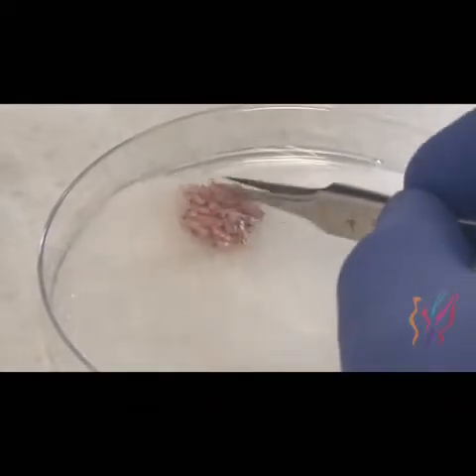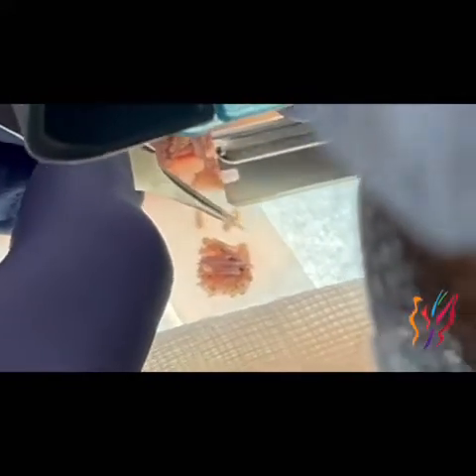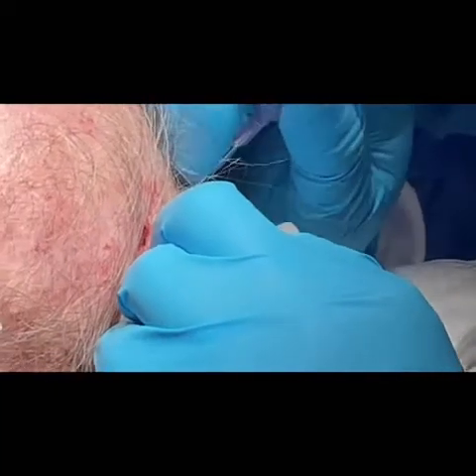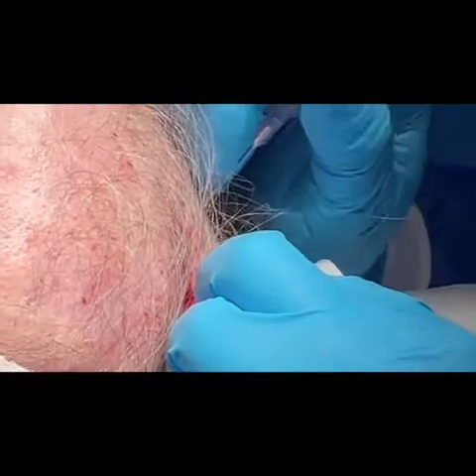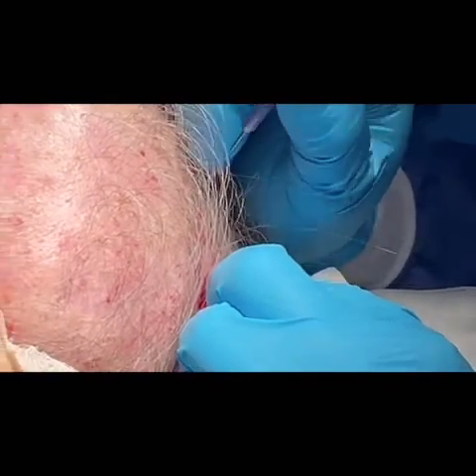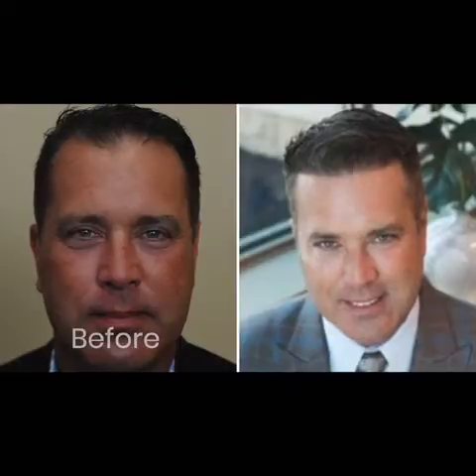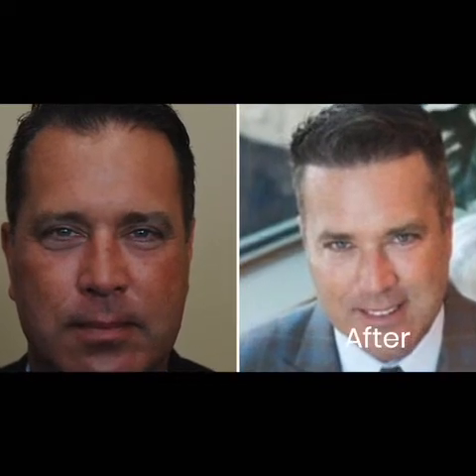Depending on where the grafts are going to be placed, for example in the hairline, the follicular units are dissected into single hairs. So the hairline has been drawn in, and during the second part of the day, we're making recipient sites where each individual hair is going to be placed. It's important to do it in this manner so you'll have a free-flowing head of hair. No matter if the wind blows it in any direction, it'll look perfectly natural.